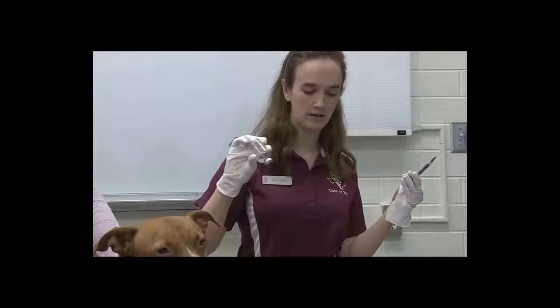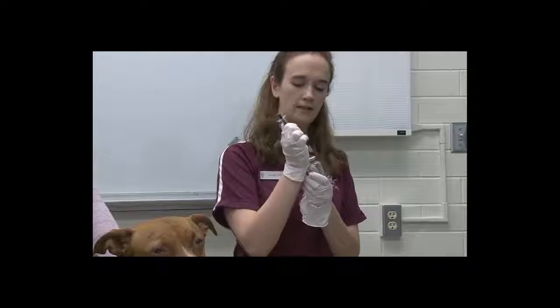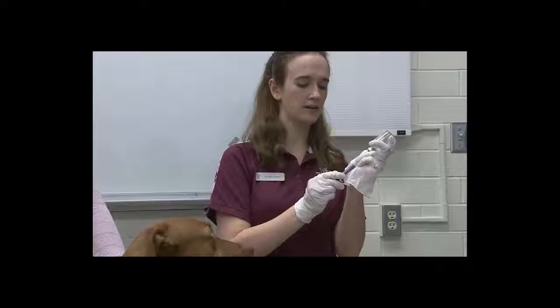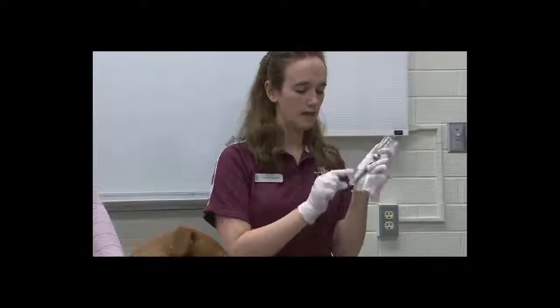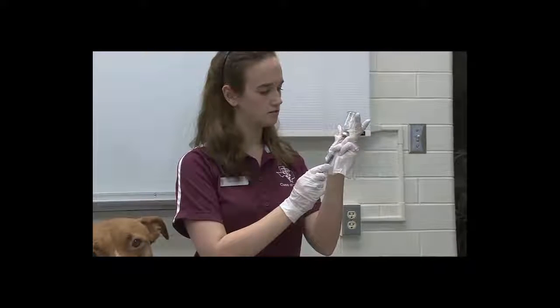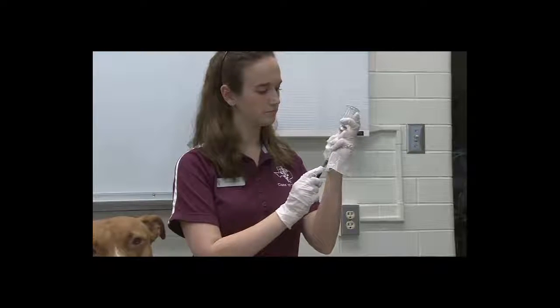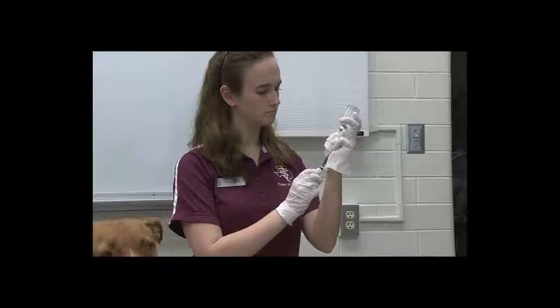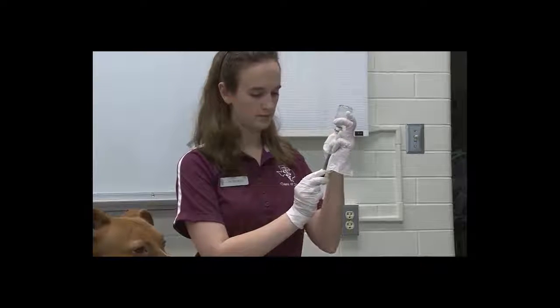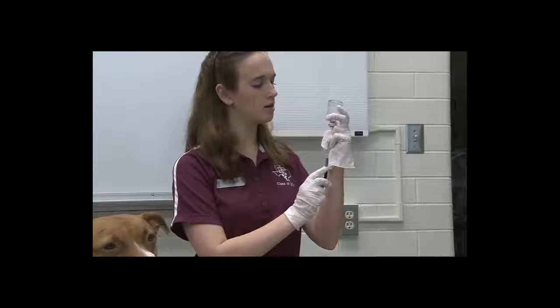Then you turn this a couple of times until it mixes well. Then you put your needle back in and pull back until you have all of your liquid. Go until you have all the liquid in the needle.